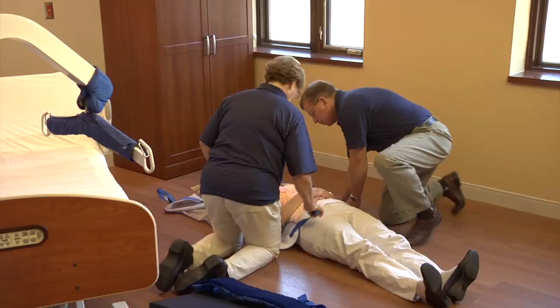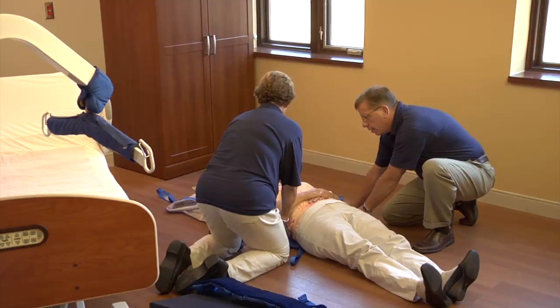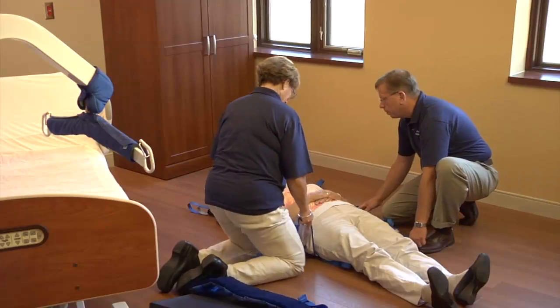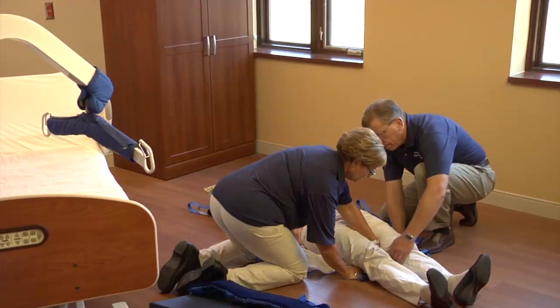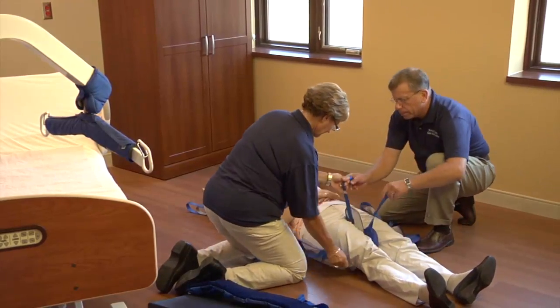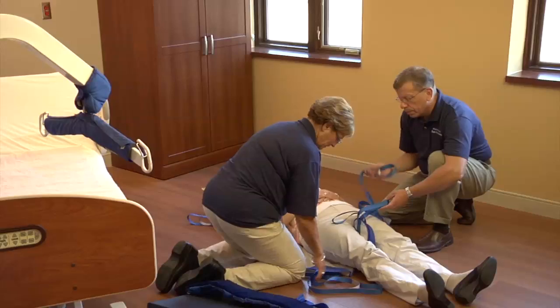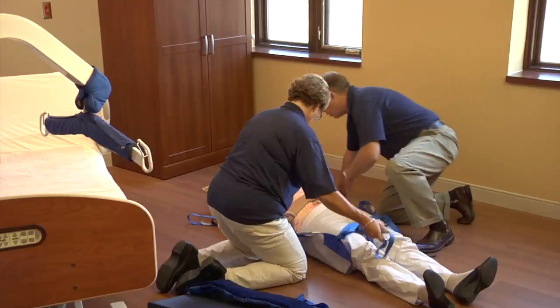We use that sling applicator tool, those two pieces of plastic, to slide that sling from the head of the patient down to their toes. Sliding the sling under them helps us prevent the need to turn and roll that patient. Working as a team, we're ensuring that we're positioning the sling correctly under that patient before we make the transfer happen.